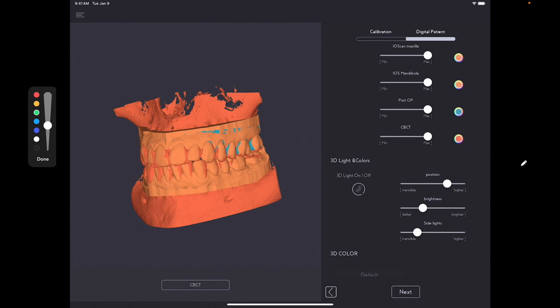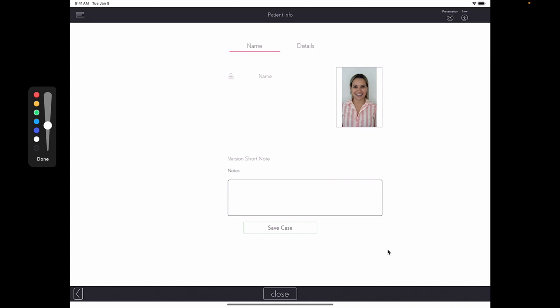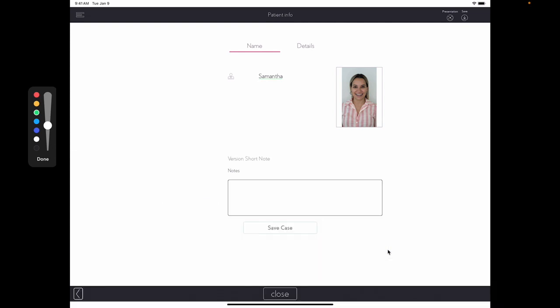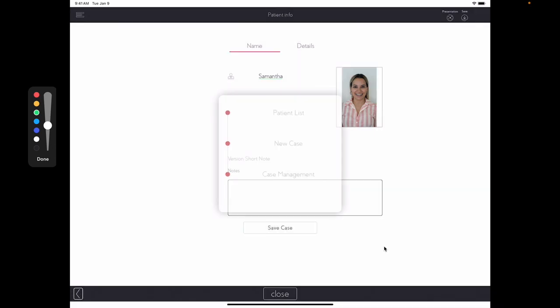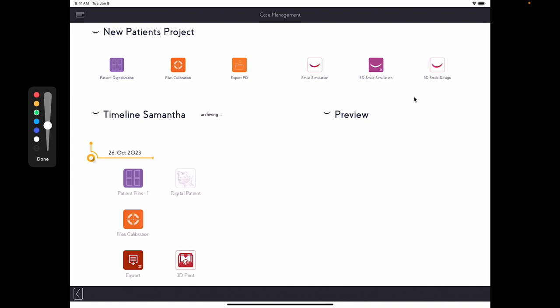Now let's save the case. You simply click over here in Next. Add the patient's name. And click Save. Once you click Save, you can go ahead and go to Case Management and begin your 3D design by clicking over here.